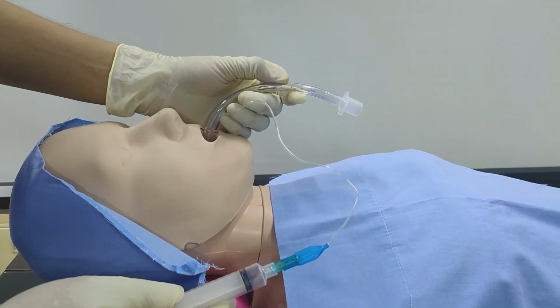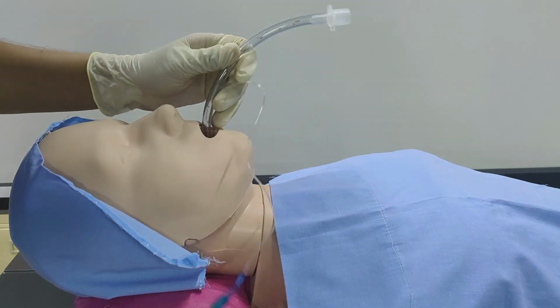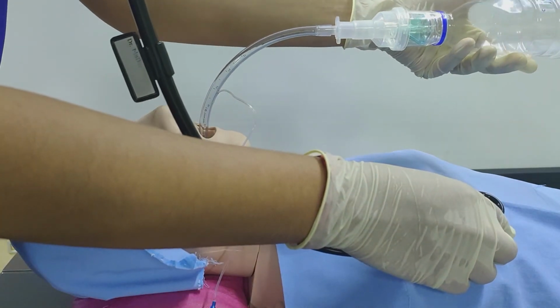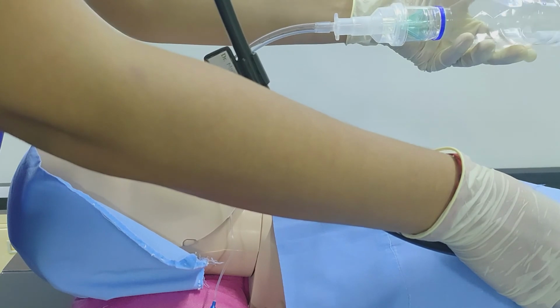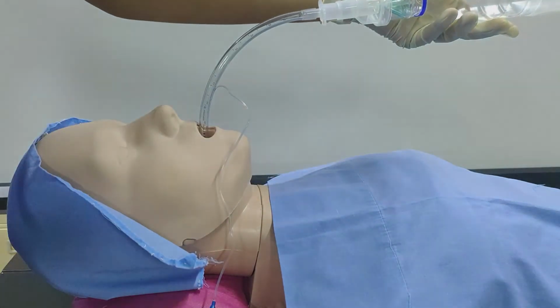To correct this, deflate the cuff, pull back the ET tube by 1 cm, inflate the cuff again, and then connect to a bag valve mask. Then auscultate to check if the breath sounds are equally heard. Repeat the steps as needed till equal breath sounds are heard. In this patient, equal breath sounds are appreciated.